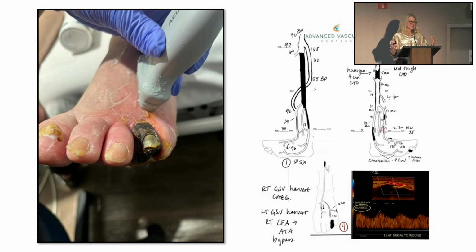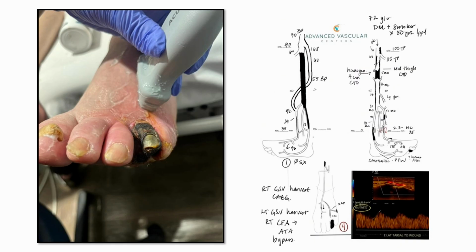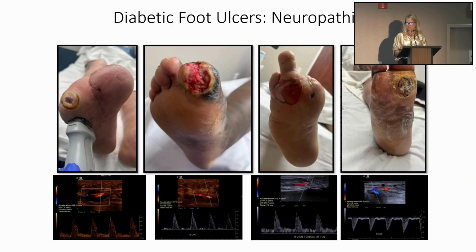And then when we put it all together, when we evaluate the patient's foot perfusion, we understand basically the target artery pathway from groin to toe. Dr. Harris or Dr. LeSar can basically look at that case and plan their intervention based on the comprehensive duplex ultrasound. It's a short CTO occlusion. It's homogeneous. I'm saying, they're probably going to go right through. And single vessel runoff via the peroneal artery. Maybe we can indirectly just get blood flow to that fourth toe by just opening that SFA.